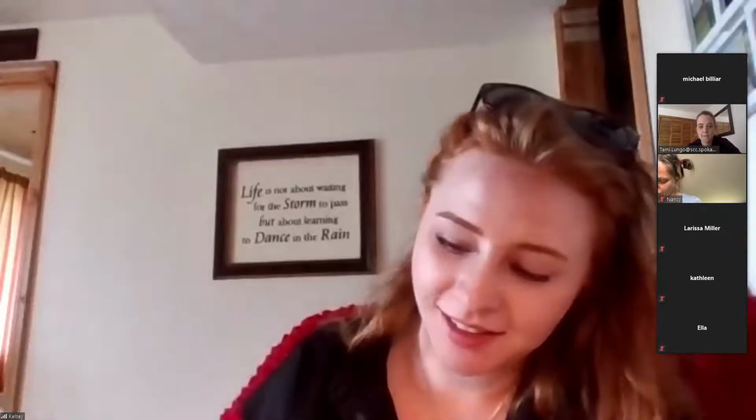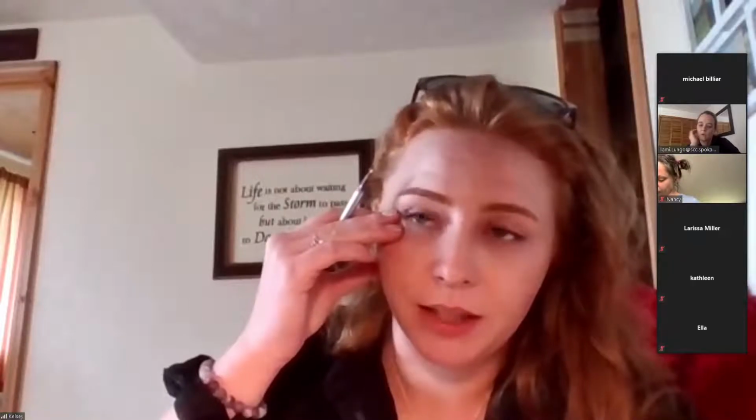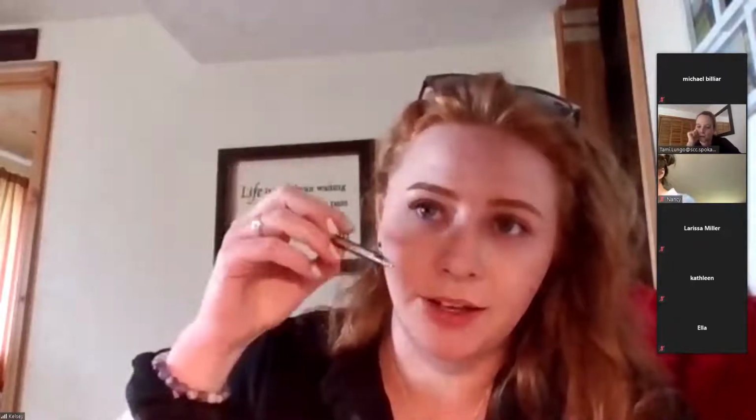So. Okay, one last question. I'm sorry. No, you're good. It's kind of off topic-ish. So it was mentioned in the slides that it's frowned upon to use angle correct in the aortic valve because it's only accounted for in 2D. But I was asking Tyler, what if I can't see my right lower pulmonary vein with an apical 4-chamber, but I can see my left upper coming in really good? Can I pulse wave there? And he's like, yeah, that's fine, just angle correct.